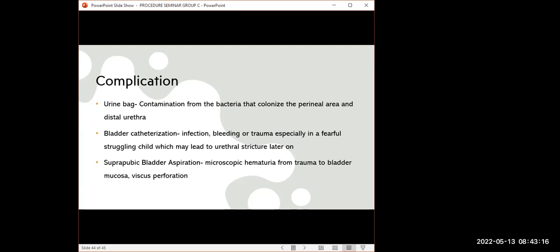Different antiseptics should be used for different methods. You don't use highly concentrated chlorhexidine or alcohol for bladder catheterization using a Foley's catheter, because it's painful. The skin down there is quite sensitive. But if you do a suprapubic, then you use a higher concentration of CHG.